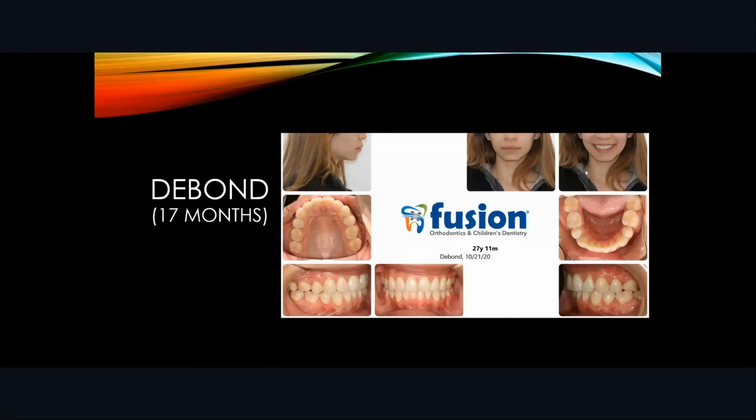Then one thing you can do is remove the appliance, leave the brackets on, and then go ahead and manufacture a series of aligners. Usually, if you can get it with, let's say, Invisalign or another commercially available aligner in about 10, at the end of a Brius treatment you should be able to achieve the same result with about 2 or 3 refiners that the company makes.